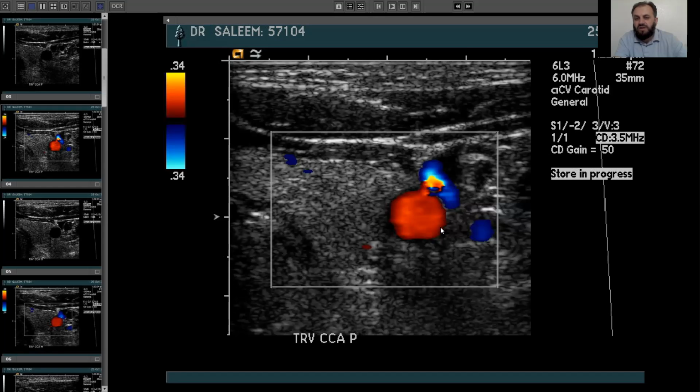And then it has to fill completely with the color if it is a normal study. If it's not a normal study, if there's a compression or any soft tissue plug buildup, which we were not able to see on a black and white or 2D image, with the color we will be able to see. Because if there is any plug, a soft tissue plug or compression on that portion, there will be missing color, missing flow, because it makes sense. If it's any part, it will be no color. We will not be able to see a flow on that area.